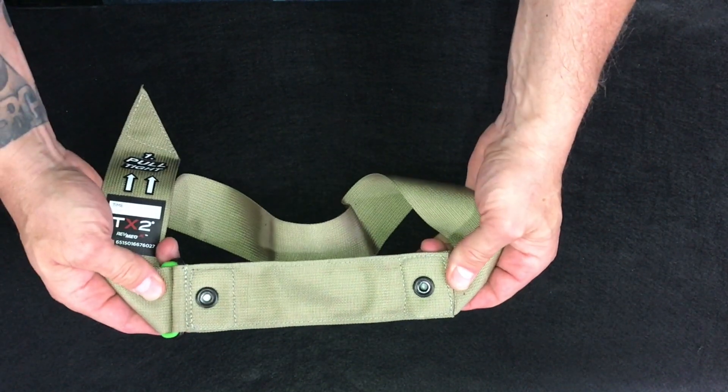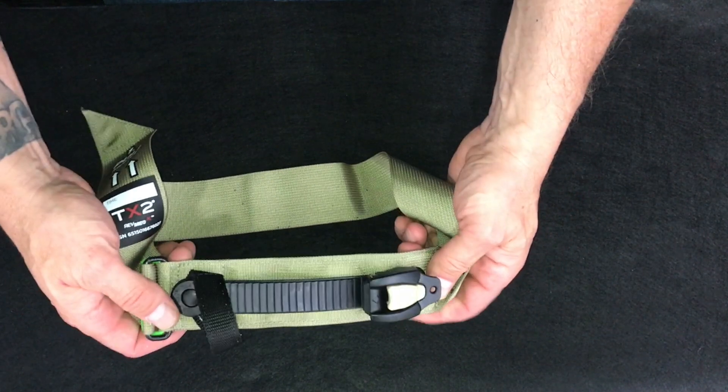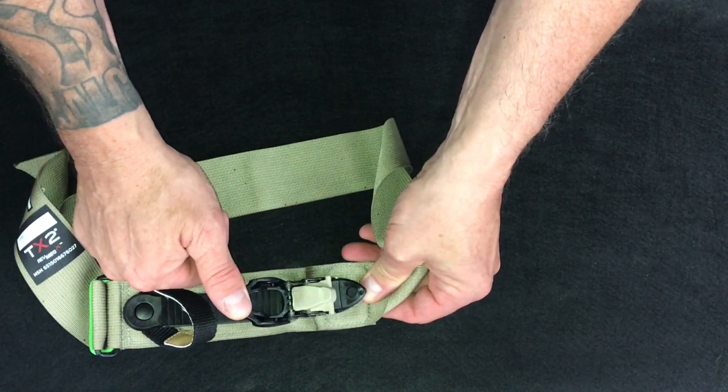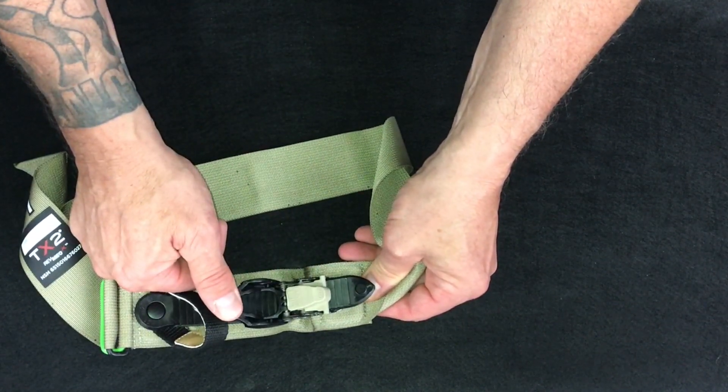The ratchet and ladder are attached by steel grommets through the webbing and internal stability plate. The ladder passes through the ratchet assembly and is tightened by lifting the lever arm on the top of the ratchet, which moves the ladder and auto-locks with every rotation of the lever arm.